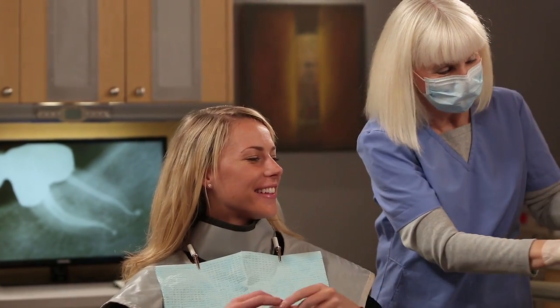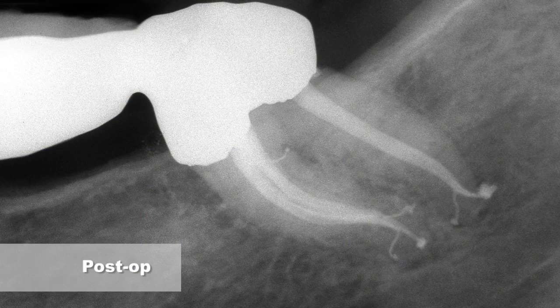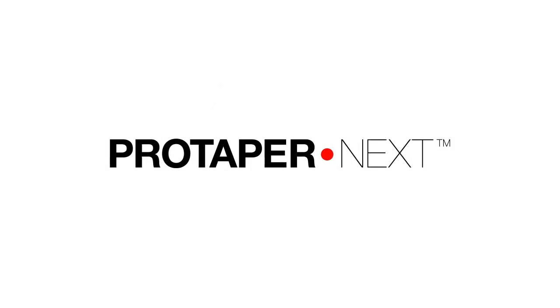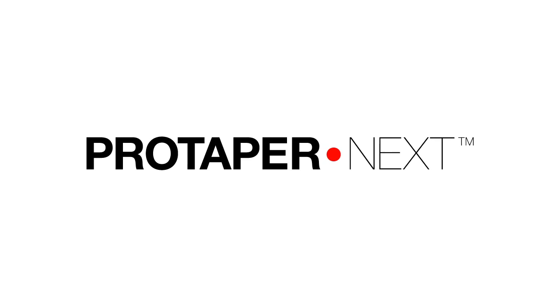When we look at the post-op film, it reminds me of the old expression, the thrill of the fill. Notice in this particular instance, we've provisionalized the bridge, we have smooth flowing shapes, and we've filled multiple portals of exit. Protaper Next sets the standard for safety, efficiency, and simplicity.